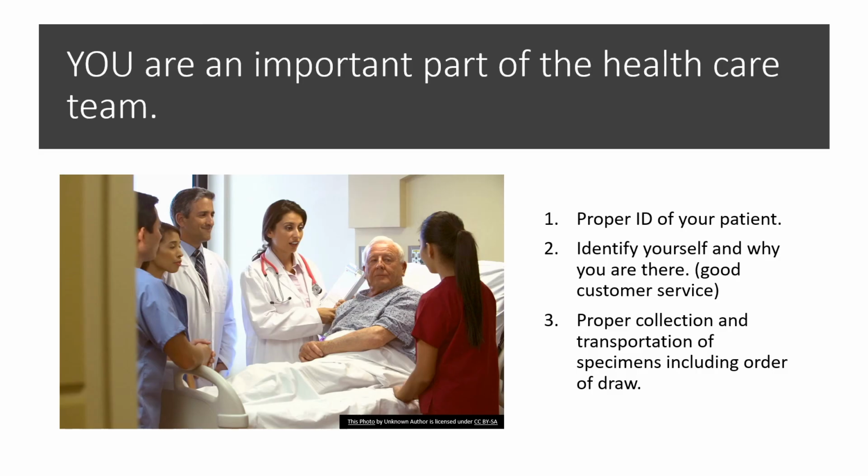So to finish up, remember, you guys are professionals, right? You're working towards being a professional, and you are a vital and important part of the healthcare team. And remember, the important parts are making sure that you properly ID your patient, that you identify yourself and why you're there. Remember, good customer service, that you have proper collection and transportation of your specimens, including the order of draw.